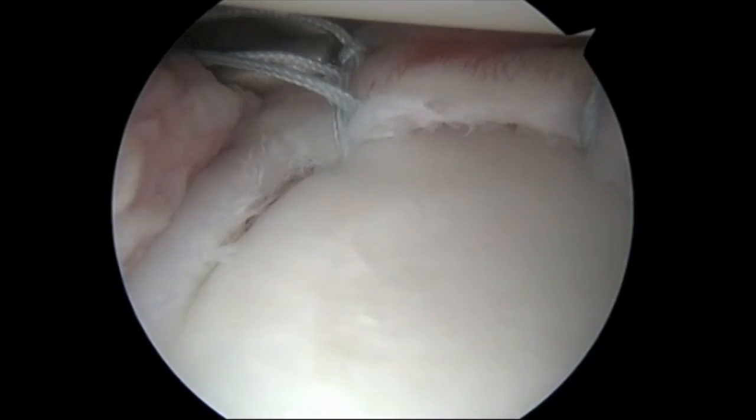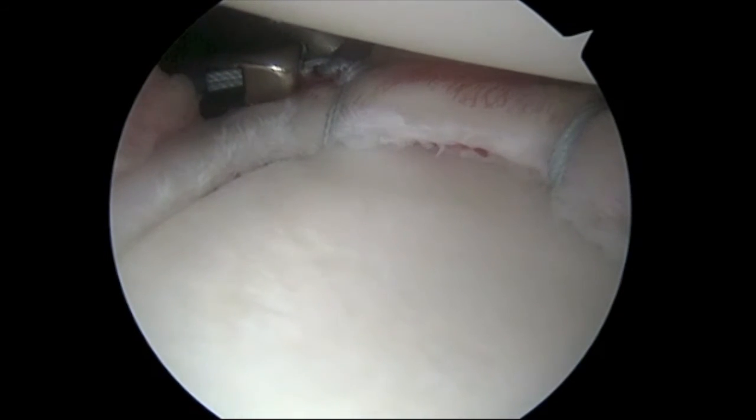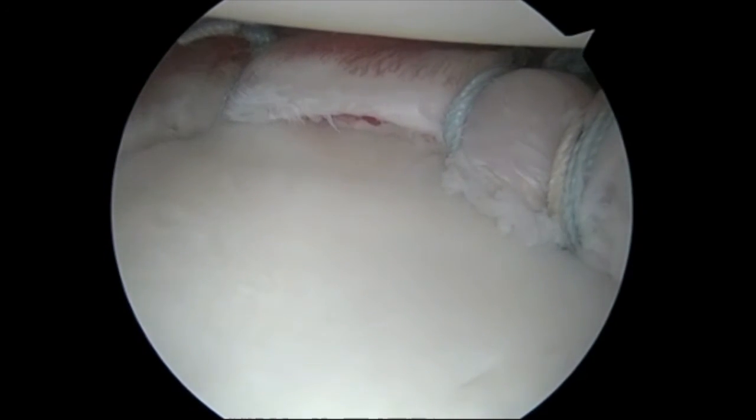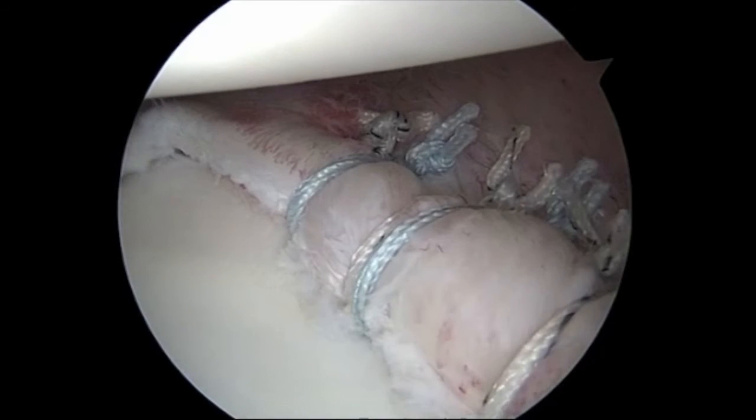So here we are putting one last one way down below. Our knot is tied and we're going to cut it. And now we can see the completed repair coming from way down at the bottom and moving up to the top of the shoulder, and we can see all the sutures holding the labrum in place.